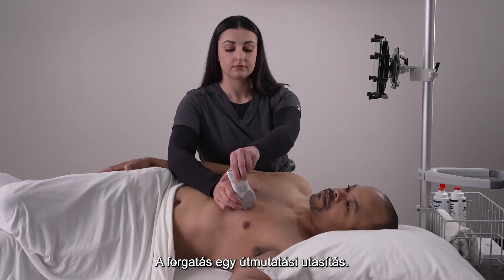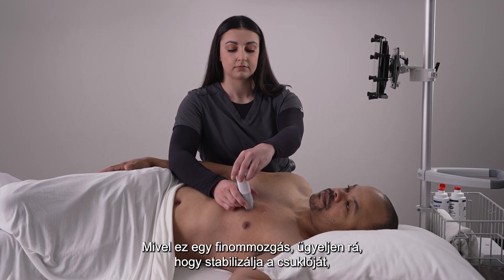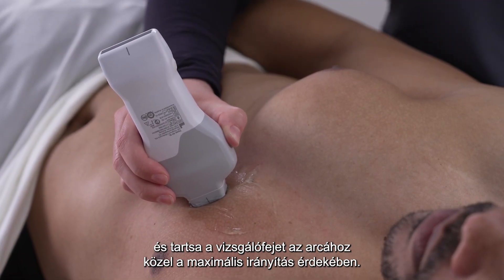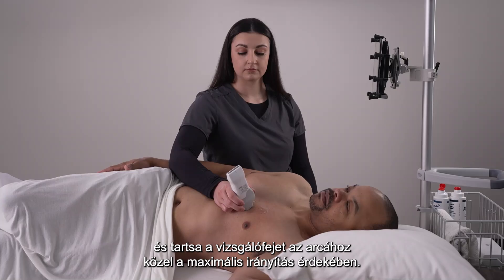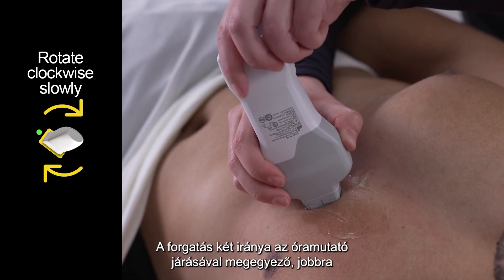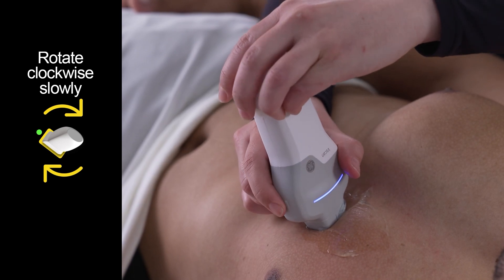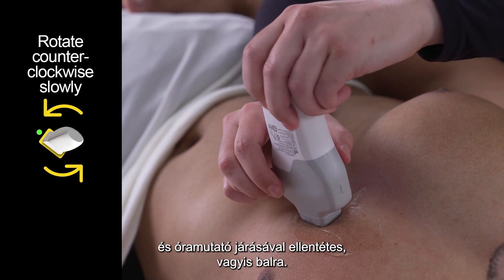Rotate is another guidance prompt. Since it is a fine movement, make sure to stabilize your wrist and hold the probe close to its face for maximum control. The two directions for rotating are clockwise or to the right, and counterclockwise to the left.